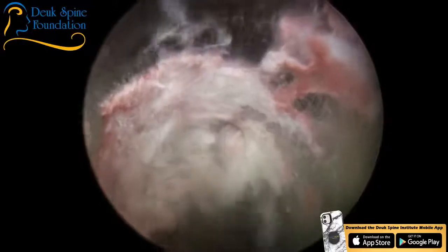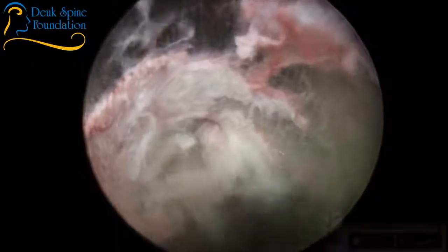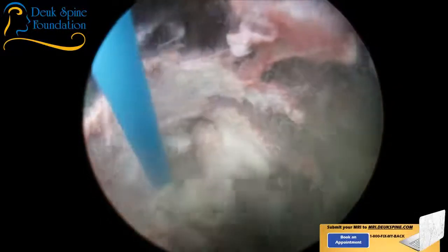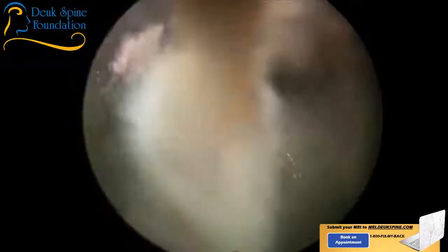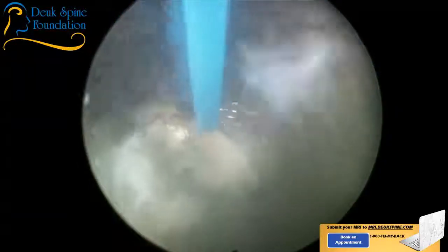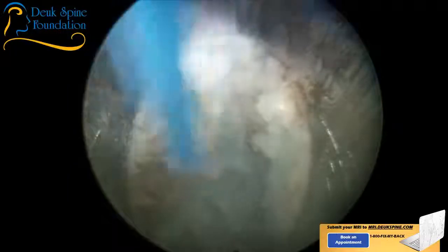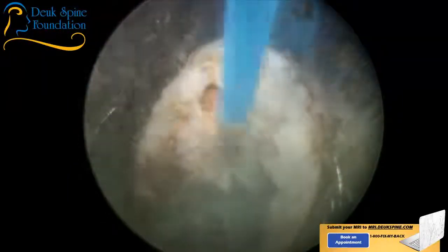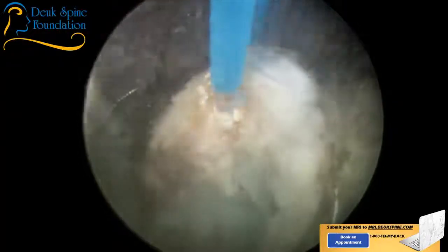Now, both of these discs have extensive damage internally. And surgeons and doctors that treat back pain have known about a condition called internal disc disruption for many years. And this patient has internal disc disruption where the inside of the disc is massively damaged. You can actually see it on the MRI. On the MRI, the discs are very dark.